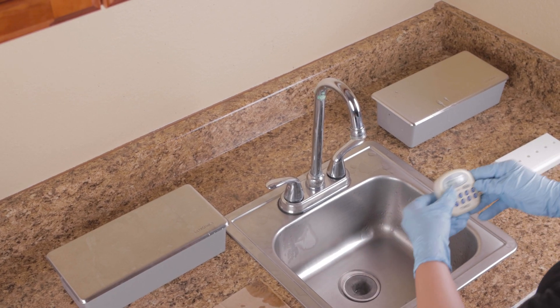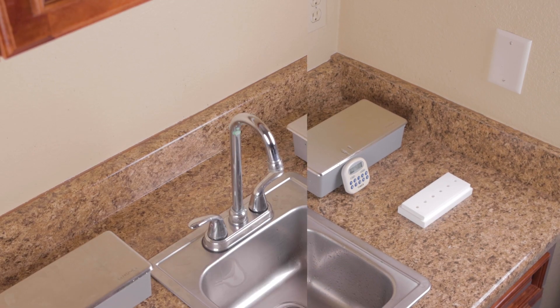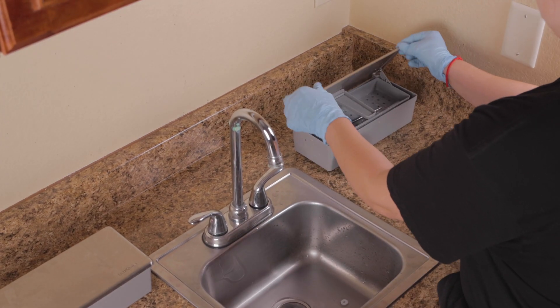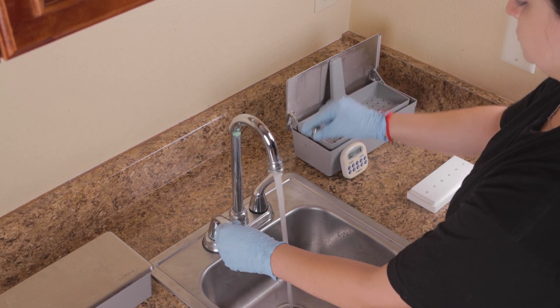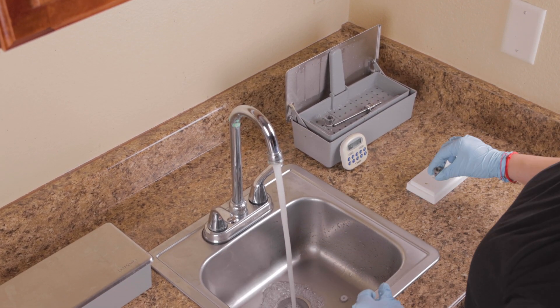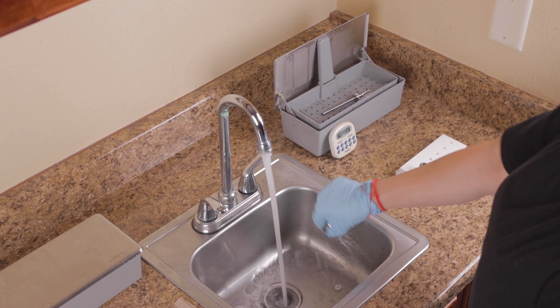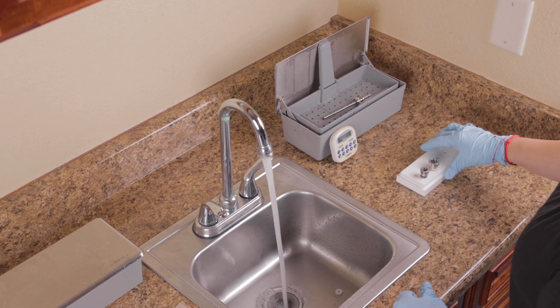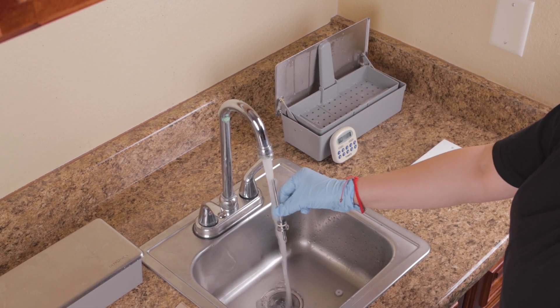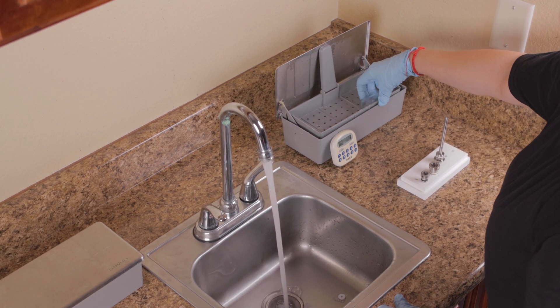Soak all hydro wand components in disinfection solution for 10 minutes. Remove the components from the disinfection solution and rinse them with water. Finally, set them upright to dry.